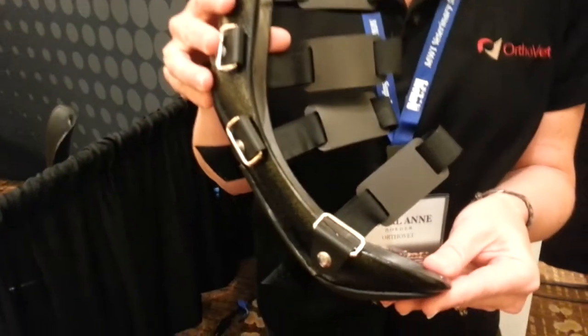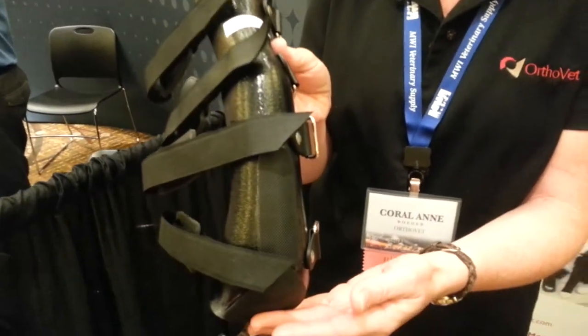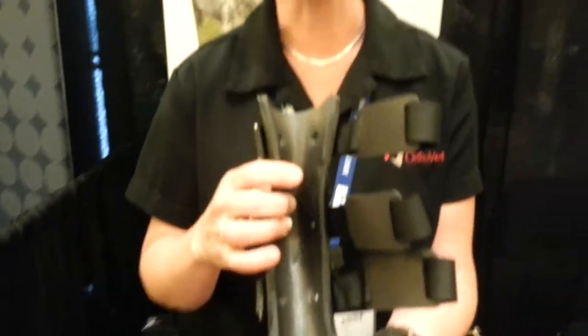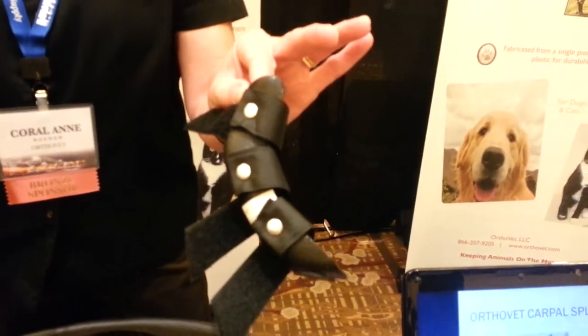I'd like to tell you a little bit about our standard product line for OrthoVet. This is the OrthoVet rear limb splint. These are a rigid lower limb splinting option, coming in a variety of sizes, from extra large down to our smallest size, which is our little feline or small bird dog size.